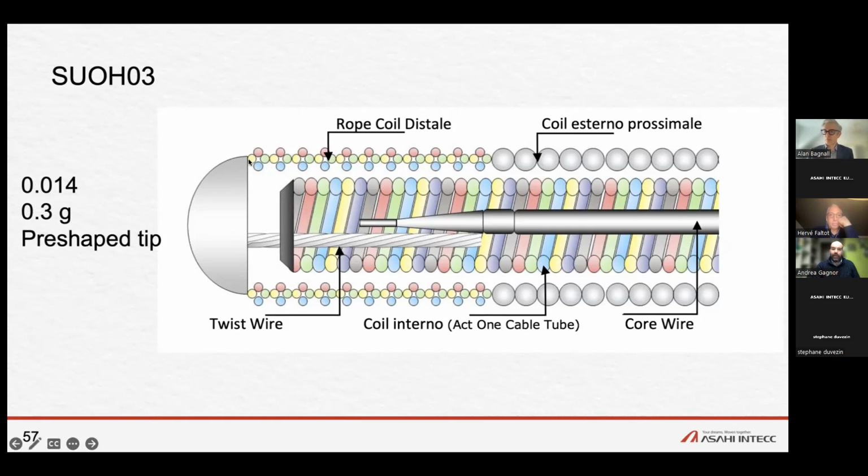And the main reason is the fact that if you think of this point about a single wire, you have some kind of rigidity. If you think about this space, about 4 different single wires, you have some more free space inside, which makes the coils a little bit more able to be flexible and to follow.